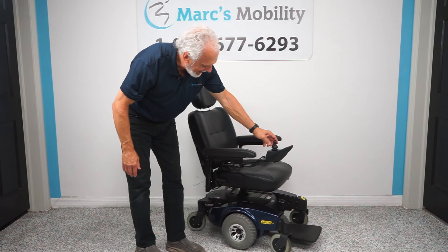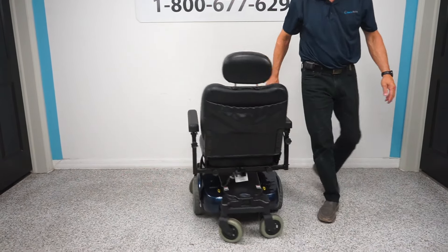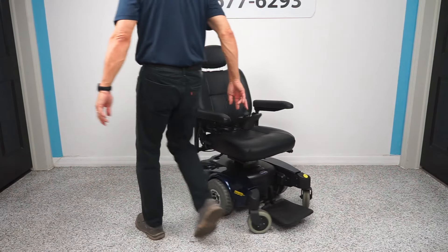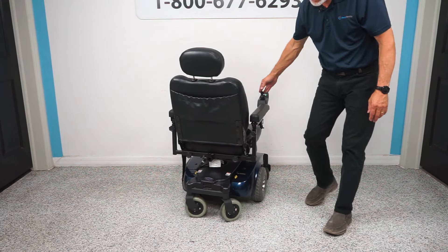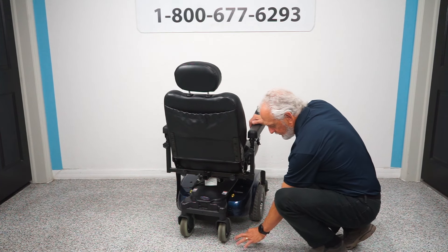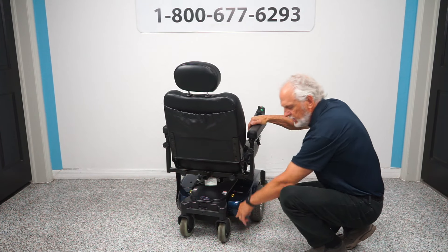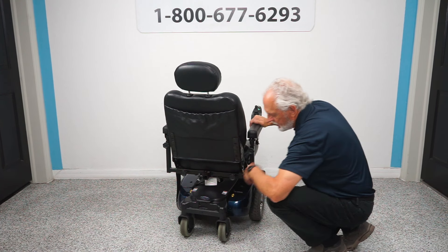What else makes this chair fabulous? It turns fantastic — it has a really small turning radius, it turns on itself. Another thing: the back wheels are not lined up with the drive wheels. So when you turn, there's less chance of hitting your walls because everything is recessed in the middle.